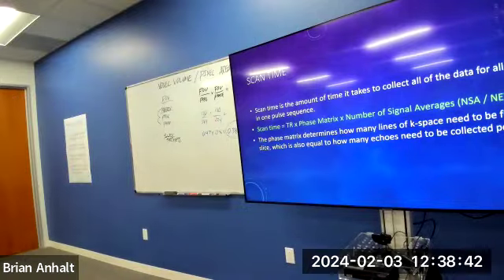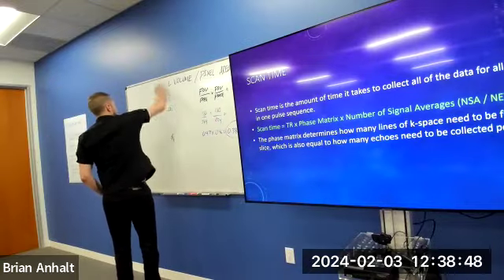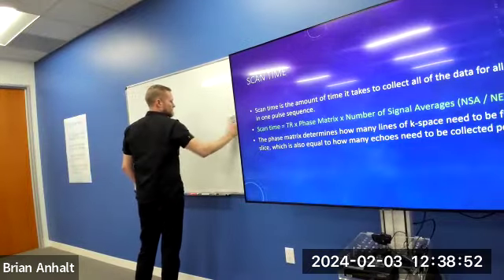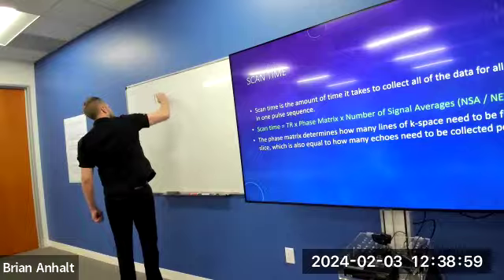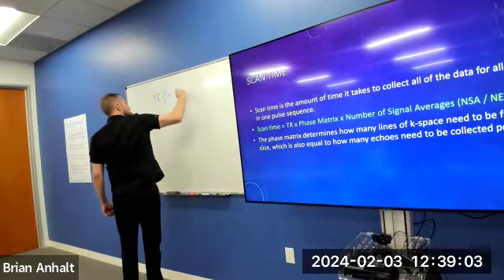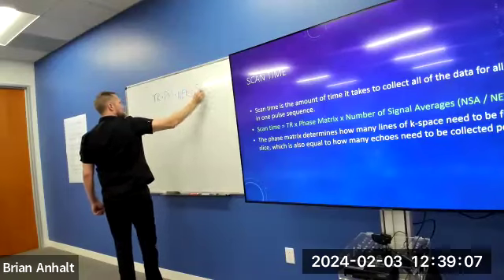That is your scan time equation right there. TR times phase matrix times NEX equals scan time.